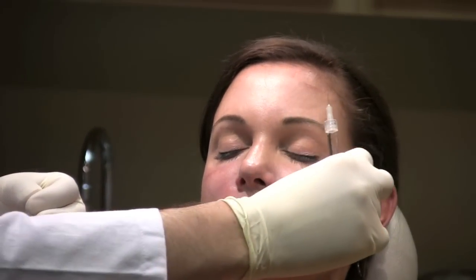In your first few times that you do this, you should mark the face so you know where you're going, and make sure you do it symmetrically. After a while, you'll see that marking is something that patients can do without. Even though the markers are erasable, it takes several days to remove them completely. Also, you don't want to make a huge case out of this. You don't want to spend 45 minutes doing this injection. The longer you take, the more you inject, the more swelling and bruising you'll have. So you want to do this as atraumatically and as quickly, but as meticulously and symmetrically as possible. What I'm going to do for this part is put her head back a little bit.